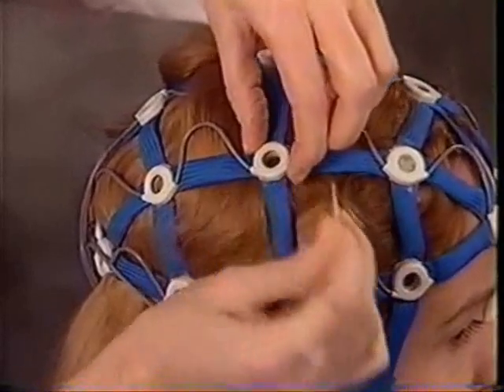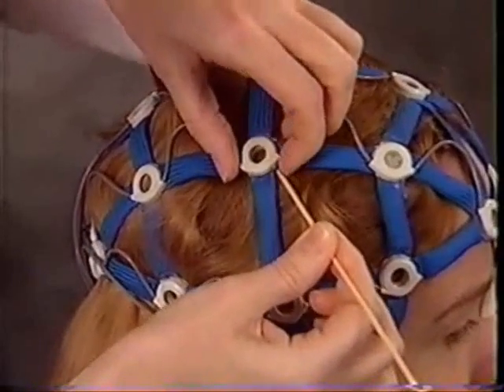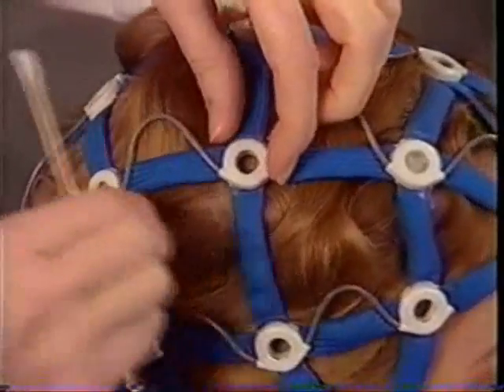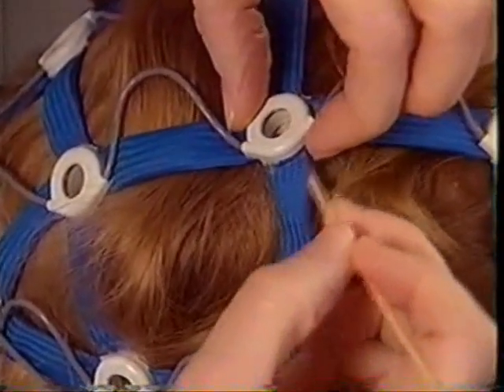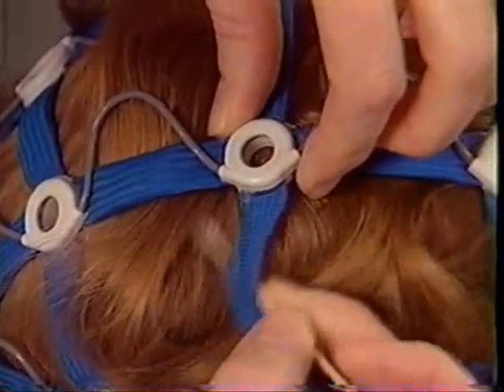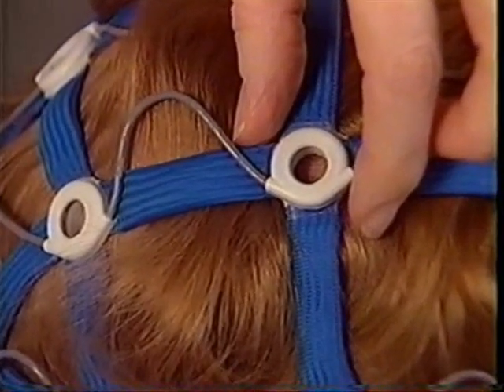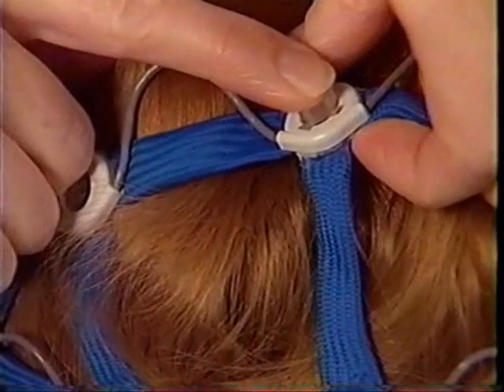Repeat the procedure. Tilt the socket, part the hair away from the center of the socket. Prep the scalp. Sweep the hair back as you remove the swab. Insert a biosensor, tilting the socket slightly for leverage, and press to assure contact. Continue applying the biosensors in this manner.